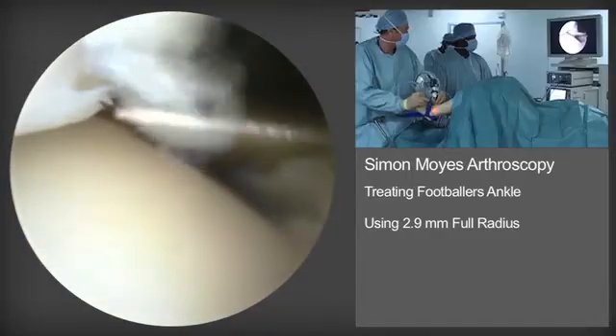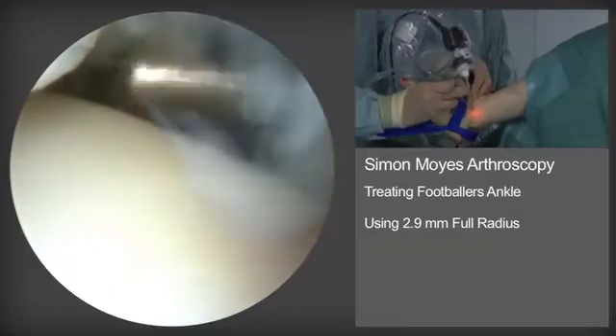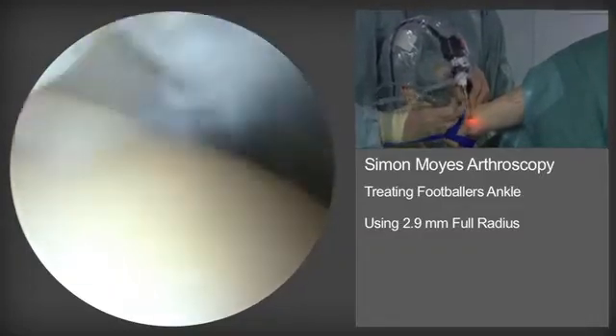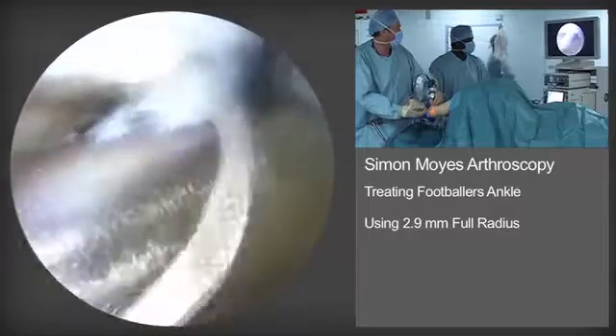Pressure is normally maintained at 80 millimetres of mercury. The teeth of the shaver are at all times kept away from the articulating surfaces. Here one can see me removing soft tissue from the undersurface of the anterior tibial spur.